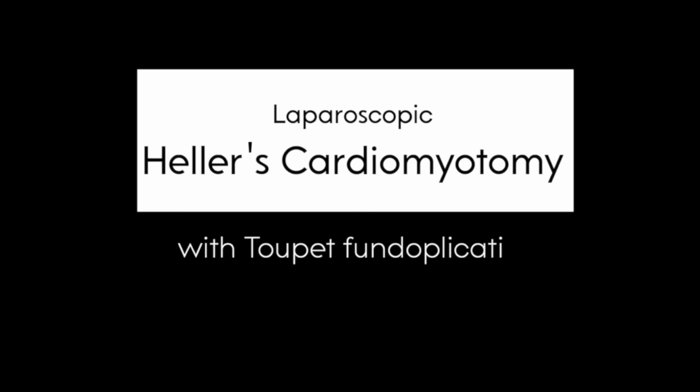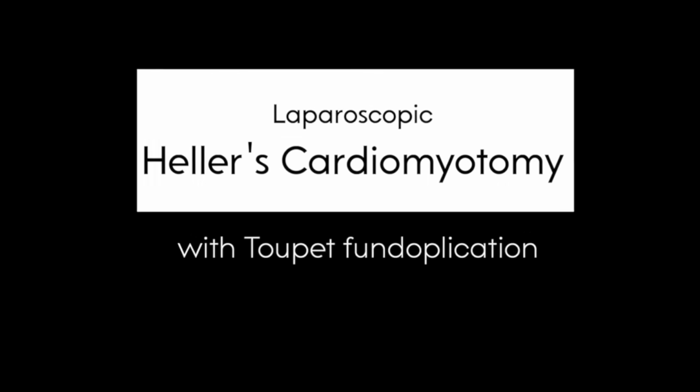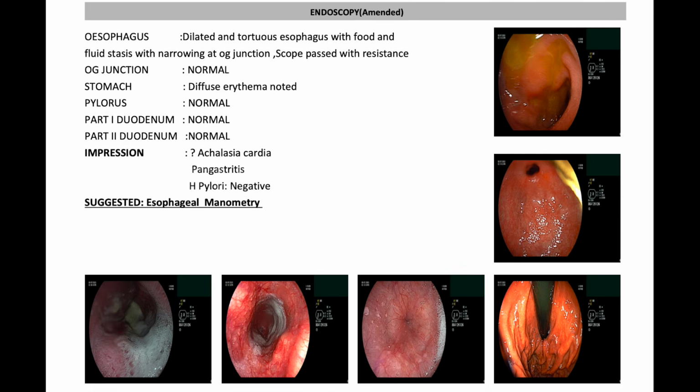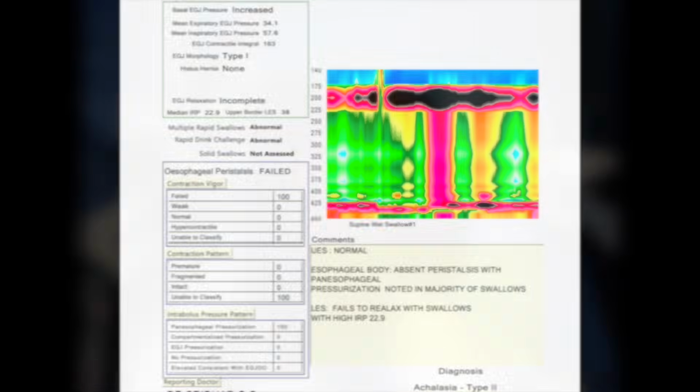So, this is the second video of Lap Heller's cardiomyotomy series. The diagnosis is type 2 achalasia cardia. You can see the barium swallow, a delayed film, shows delayed emptying, and endoscopy shows a dilated esophagus. In all cases, endoscopy is a must to rule out pseudoachalasia. The manometry shows type 2 achalasia cardia.